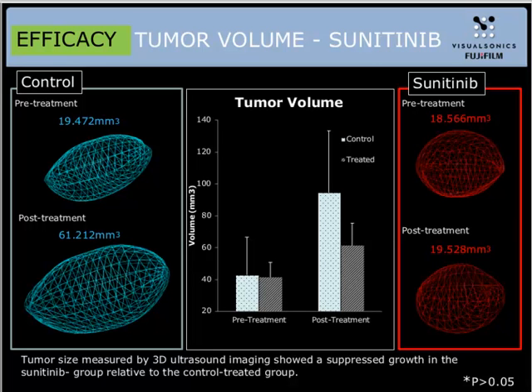So this is a very, I would say, robust and well-used technique with the technology. All of these volumes are measured using 3D ultrasound, and it is really a very good way of assessing the efficacy of the different treatments that you may be applying in your studies.